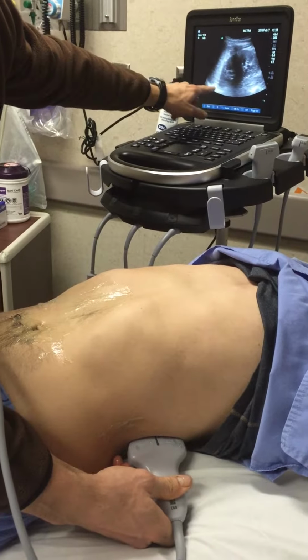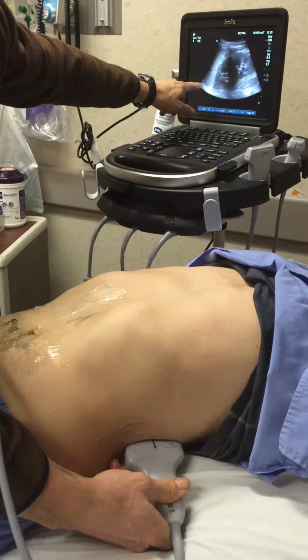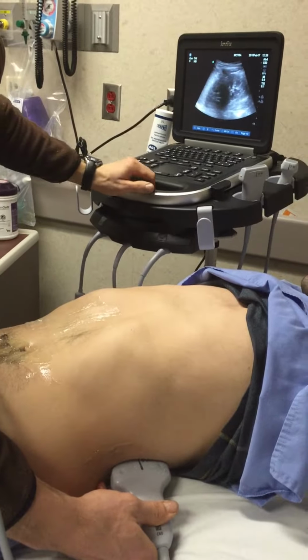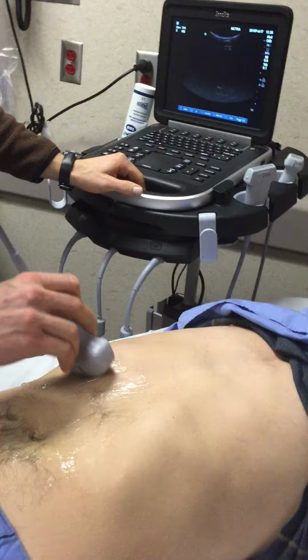Furthermore, you're looking for free fluid superior to the diaphragm here, which you do not see. And then you'd also fan through for completeness to make sure you didn't miss any small amount of free fluid. And then you finish your FAST exam with a subxiphoid.